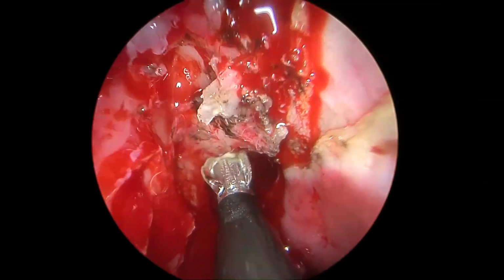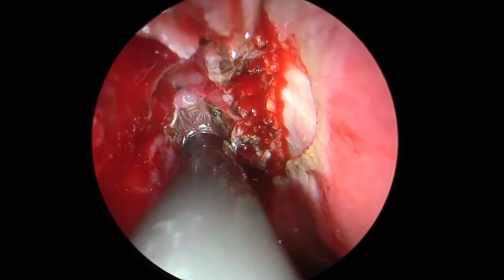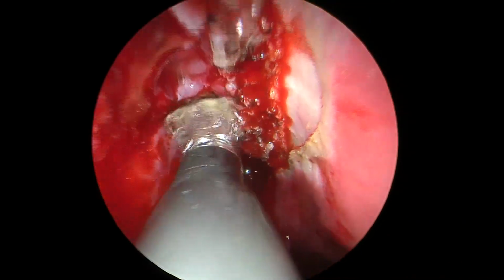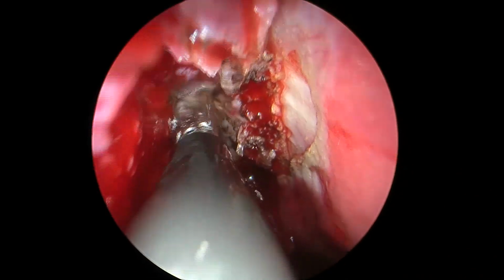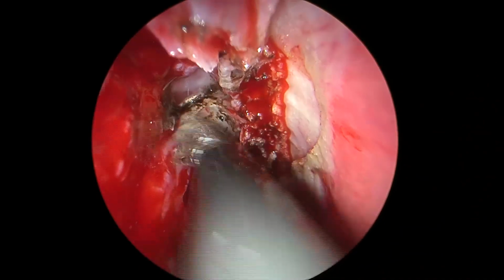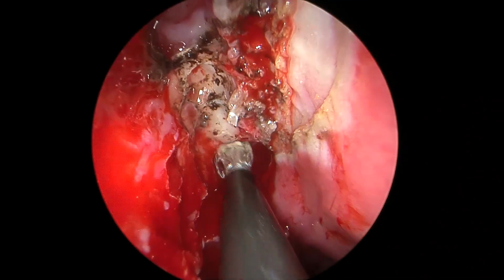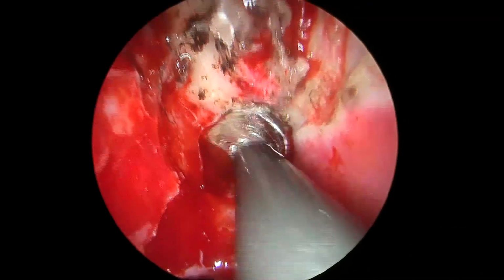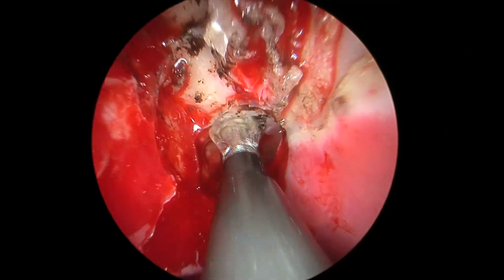Now you see how the superior part of the septum, the septal mucosa, has been taken down. Again, we are avoiding going too low to avoid injuring the septal artery. You can see how the anterior ethmoidal roof is now being coagulated broadly with the ablation mode on the coblator. This is to achieve hemostasis, and most importantly to achieve clear bare bone for our grafts to adhere. This is the roof of the posterior ethmoid and the sphenoid, which is now being ablated.